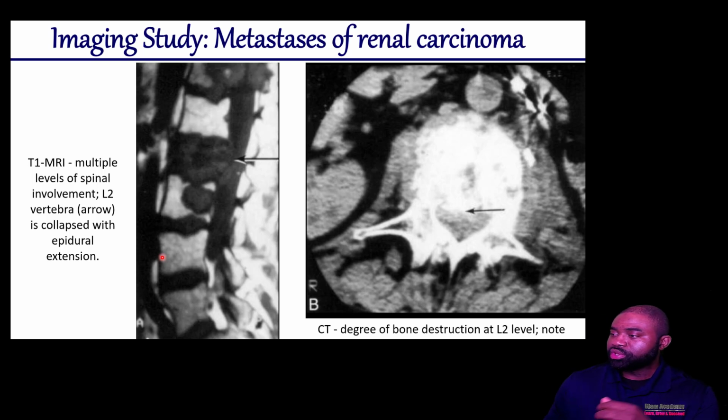And so if you look at these images here on the board, the very first image is a T1 weighted image, and in a T1 weighted image you could clearly see that the spinal cord here appears dark. If it was a T2, the spinal cord would appear brighter because the cerebrospinal fluid actually is brighter in T2.